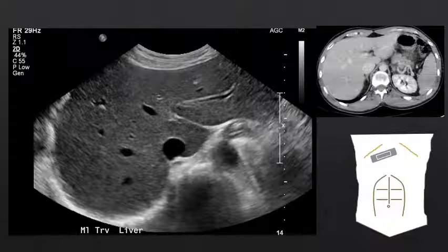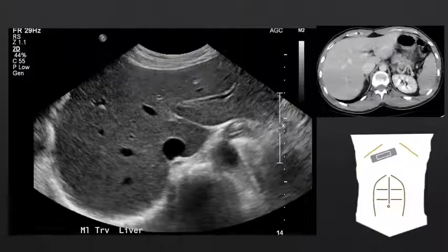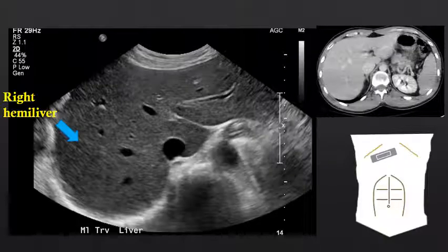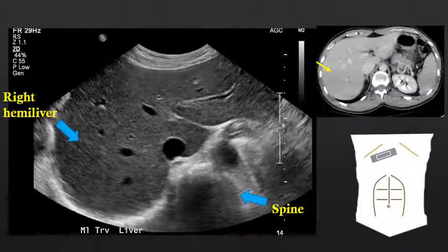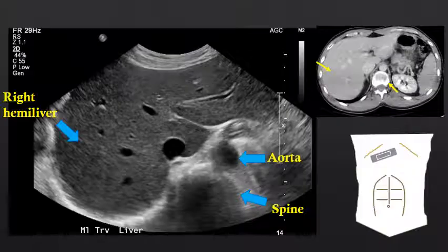If we move into a more oblique transverse position under the costal margin, we will now see the right hemiliver. Deep to the right hemiliver, we see the spine, again demarcated by a thick hyperechoic line with shadowing deep to that line. We can see the aorta just on top of the spine.